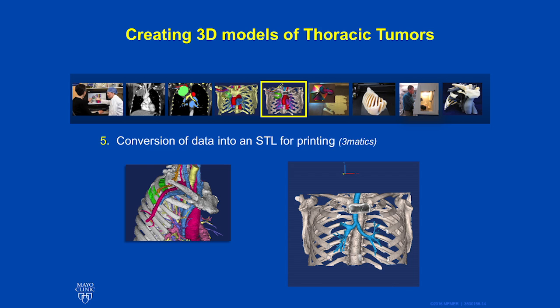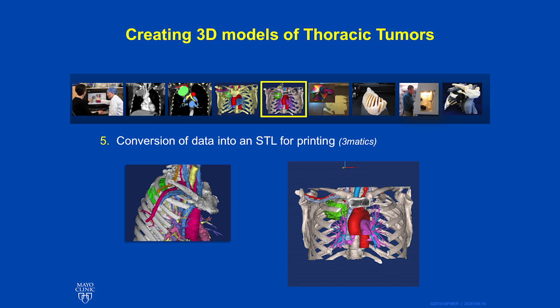We utilize certain software programs called blocking or multiple slice edit. Multiple slice edit looks at 3 planes to get the best view of the tumor and create the final 3D image. It is important to always go back and check the original images and ensure that the editing matches the original parameters of the tumor. With some of this editing, creative license is taken, and one should be careful, and one should be sure that those images are in context with the boundaries of the tumor that we're seeing from the other imaging available.